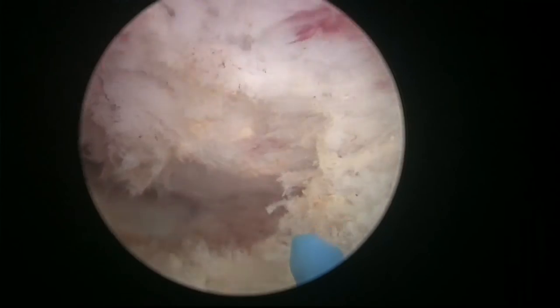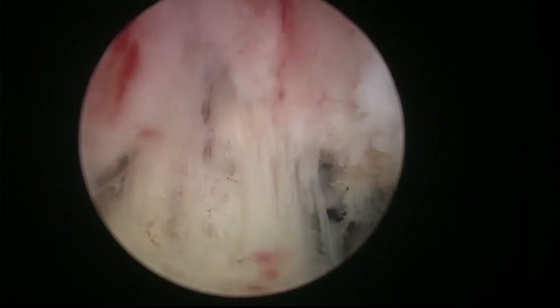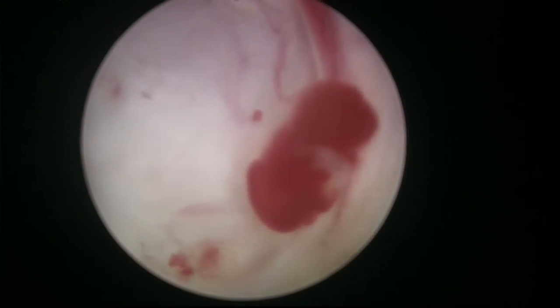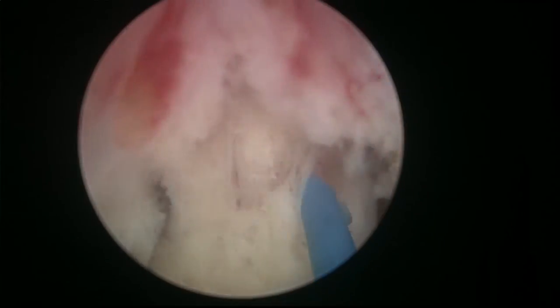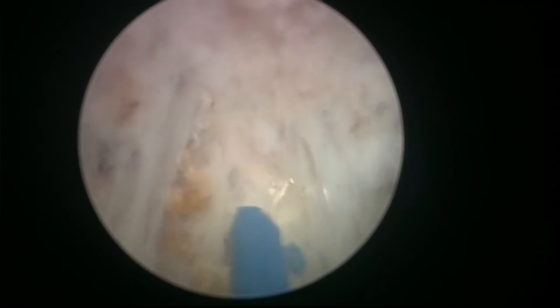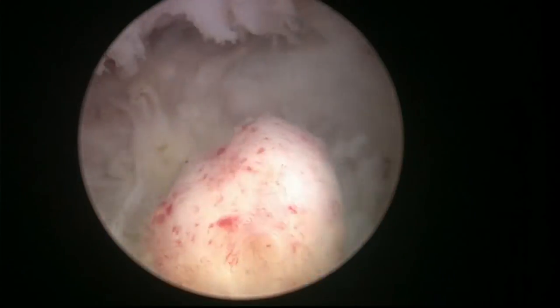I use the Richard Wolf instruments, which have a special tip that is metallic and blunt — especially good for mechanical dissection. But I don't push very hard; it has to be a gentle maneuver. Never push hard in urology — never use force. That's a good general advice for endourological procedures.